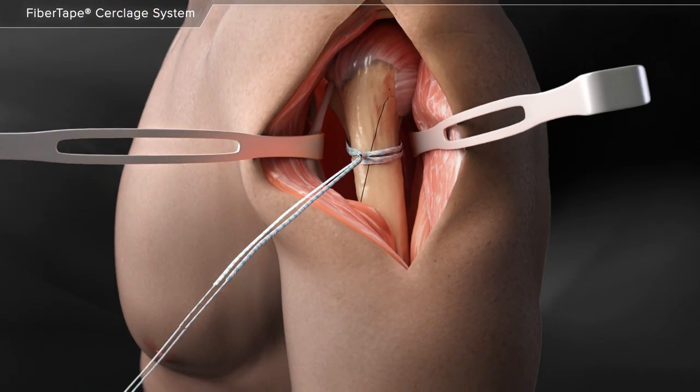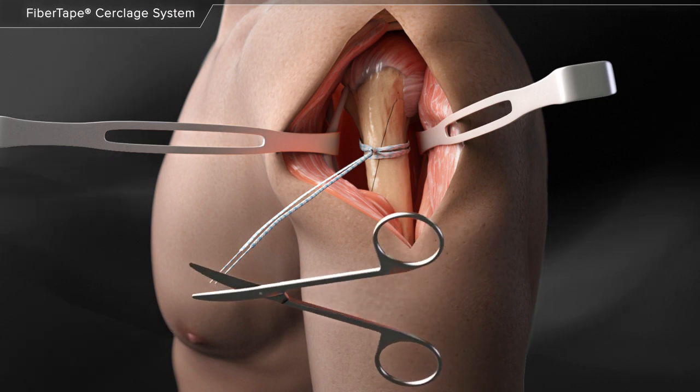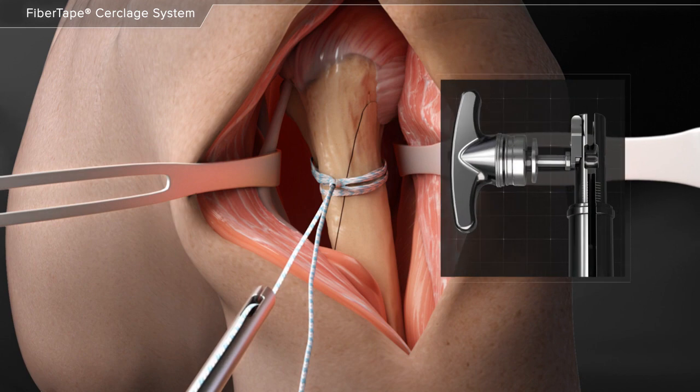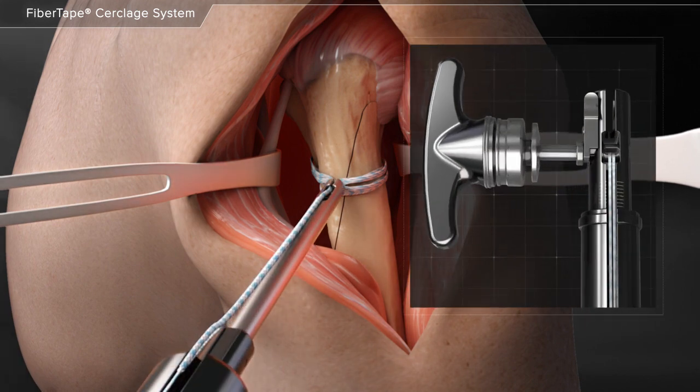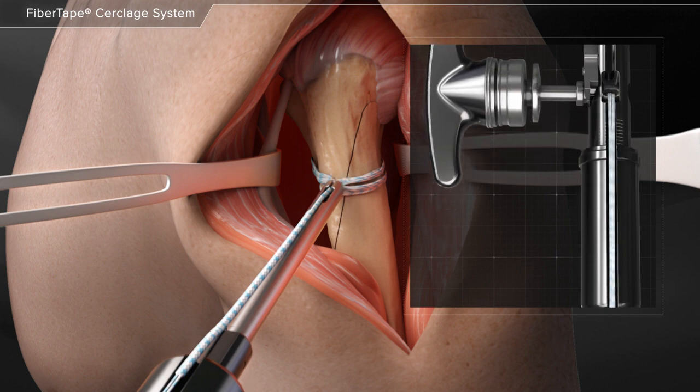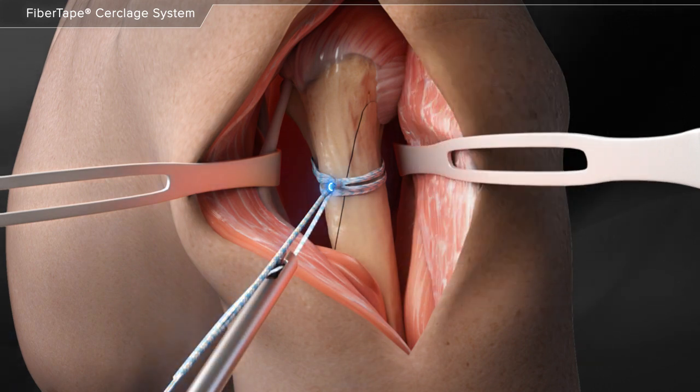The suture swedge is then cut to separate the two tails of the FiberTape suture. The suture limbs are loaded through the two holes at the tip of the tensioner and then loaded into the slot of the roller adjacent to the handle. The suture is then tensioned to the desired tension. The tensioner is pulled back and a half hitch is added.